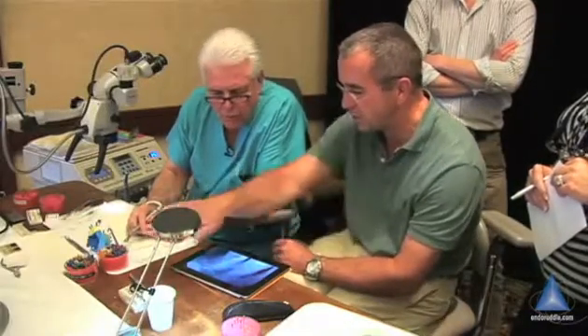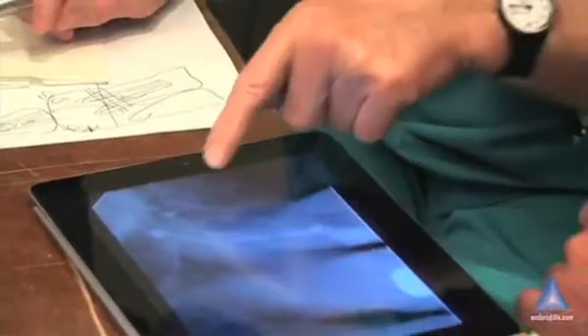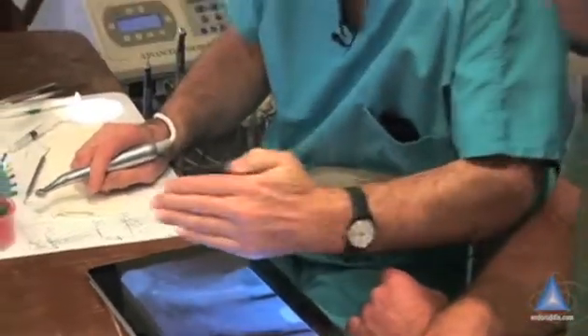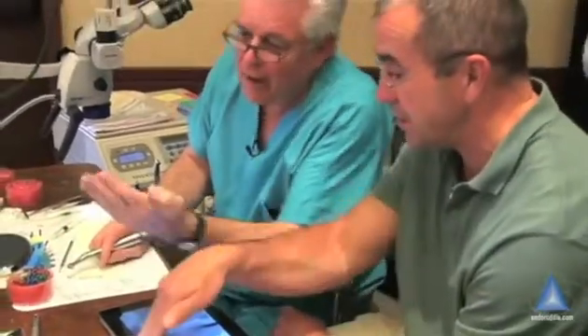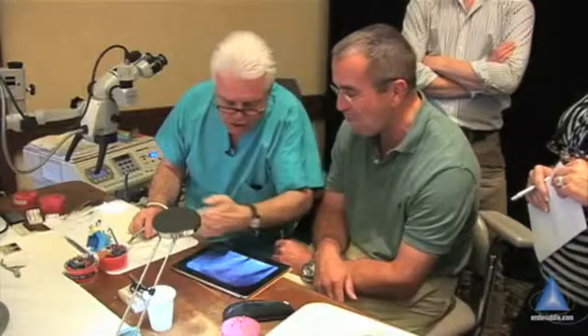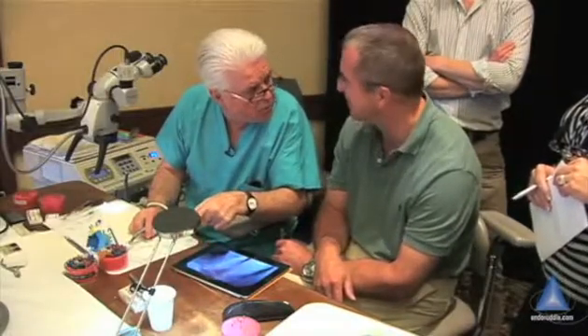Maybe there's a little twist — there is for sure. The canal is much more dangerous than this looks. This canal already is going like this, and then at the end I'm seeing it go like this. And I don't even know what it's doing buccal-lingual — this is just mesial-distal. So this is a nasty canal and it has multi-planar curvature.